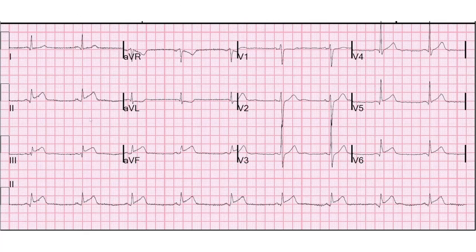Let's have a look at another one. Again, it's an inferior wall MI — and even though they're all inferior STEMIs, no two of these has looked identical, which is the reason I put them in here. Leads 2, 3, AVF have ST-segment elevation. We do have reciprocal depression in AVL, but this patient doesn't have any in lead 1 — and it's not necessary to have it in both 1 and AVL. Is it necessary to have reciprocal depression at all? Absolutely not. Because you can have an inferior wall MI from any of the three main coronary arteries, as they all terminate to some extent in the inferior wall. So you can see an LAD produce an inferior wall MI, and when you see that, you will see zero reciprocal depression.